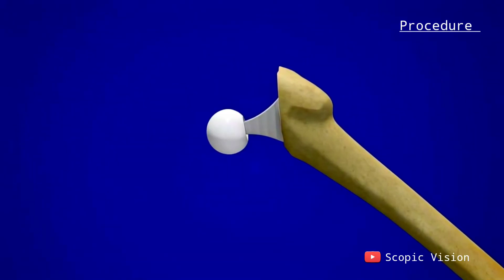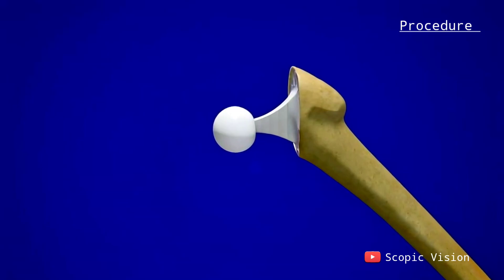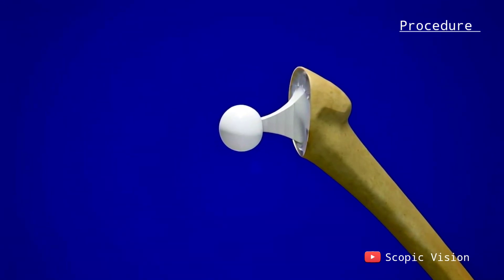The top part of the thigh bone is removed and replaced with a new implant, shaped like a ball on a stick. This new ball fits into the socket.